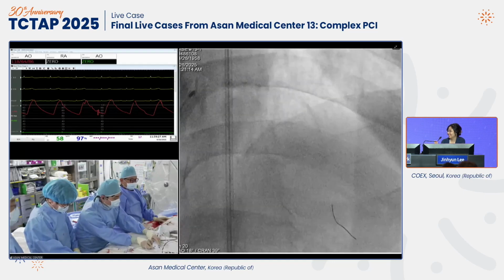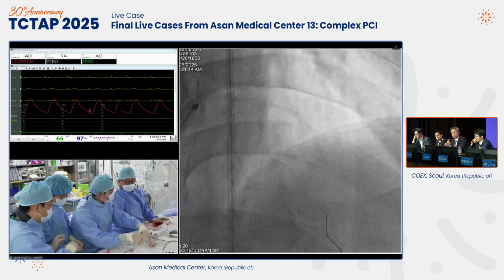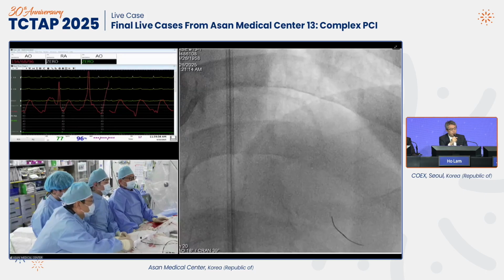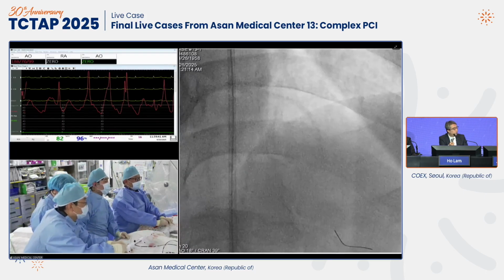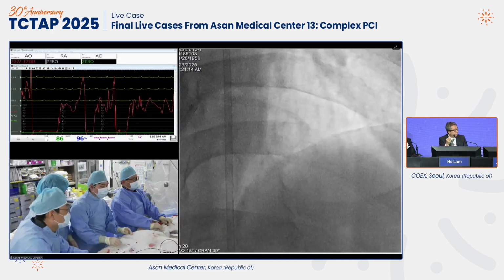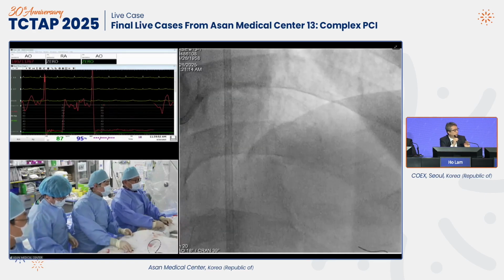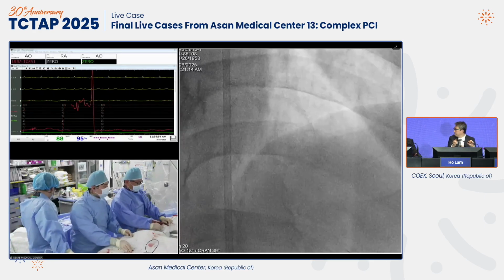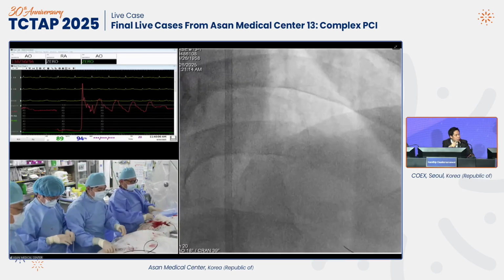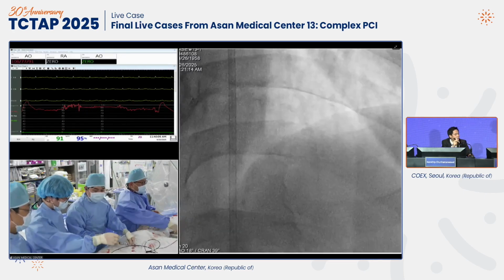For this case, because it's a very tight lesion, you may not be able to put in IVUS. Even if you put in IVUS, it's a very small lumen, so you see nothing. In my practice, I will always use a floppy wire in this eccentric case, unless it can't ablate anything, then I step up to extra support, because the risk of perforation is quite high if you use extra support. For me, I'll try to put the OptiCross IVUS catheter in first, because the profile and pushability are quite good. I think it is worth trying.